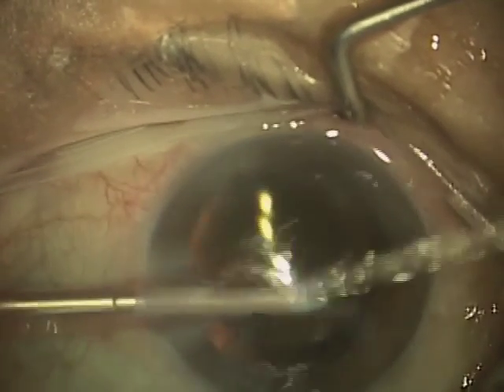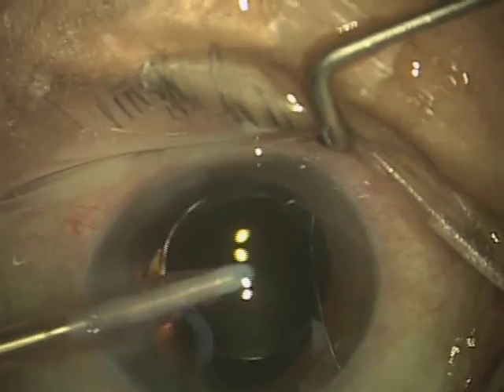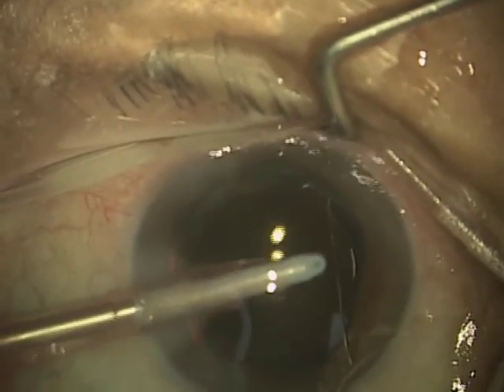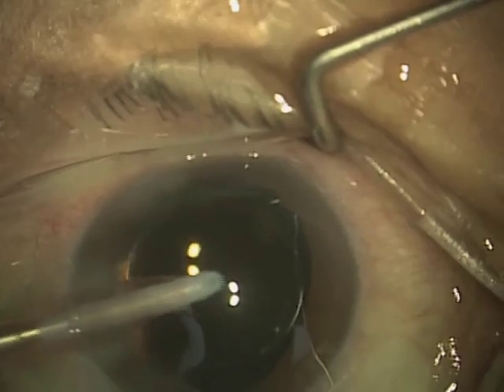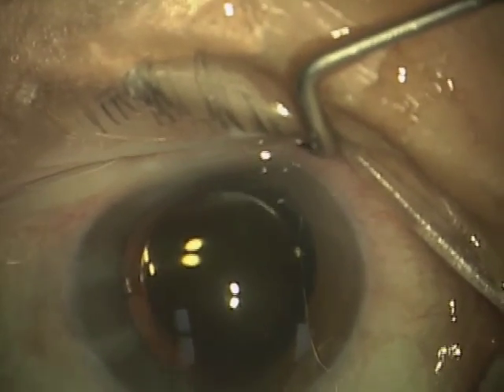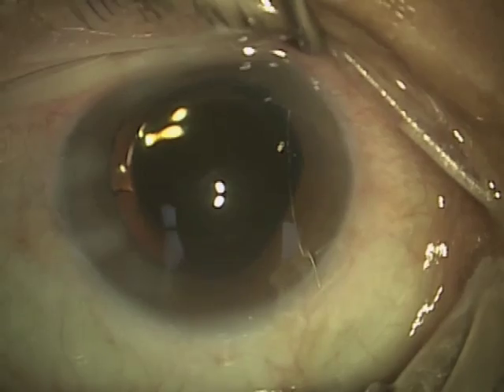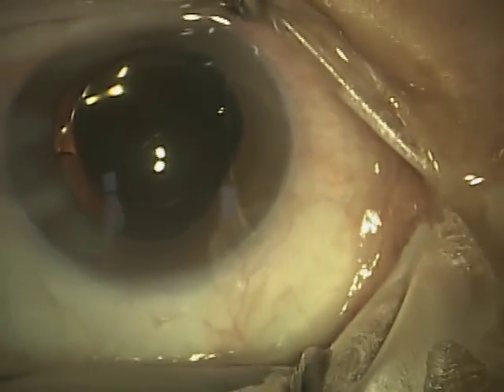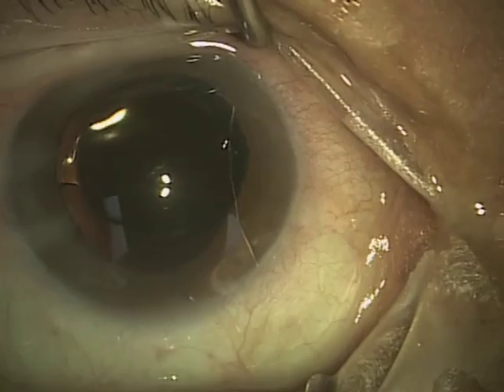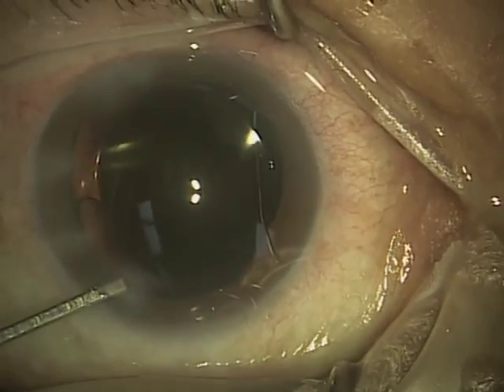Right there, I actually took the handpiece and placed the tip behind the lens to remove the viscoelastic that's behind there. Not everybody does that because you're placing the tip near the capsular bag, but my concern is that if that viscoelastic is not removed from behind the lens and it's trapped, you can get a pressure spike, which can put the optic nerve at risk. As with most things in medicine, it's a matter of weighing the risks versus benefits, and in my hands, I think the benefit of removing the viscoelastic from behind the lens is worth doing.